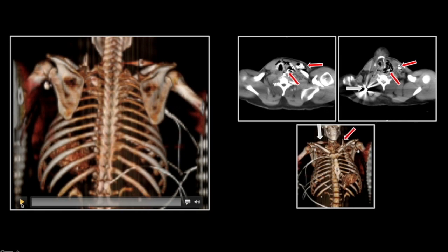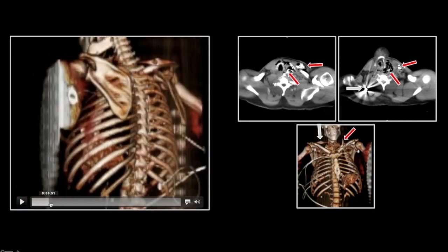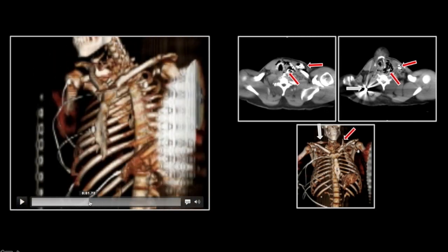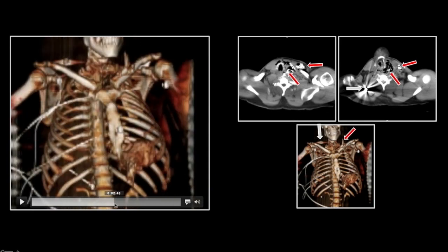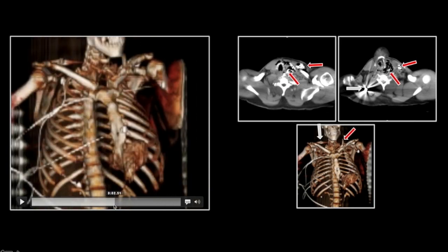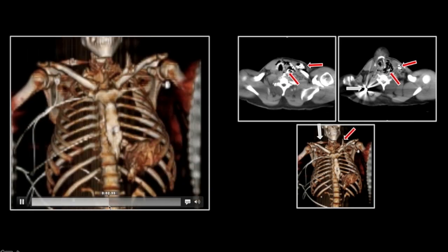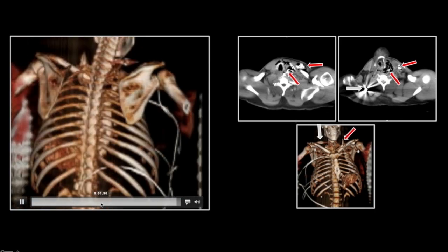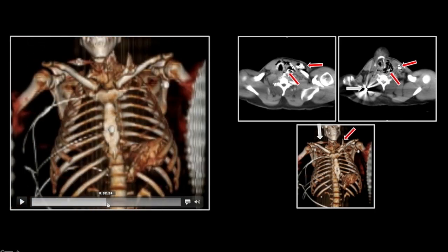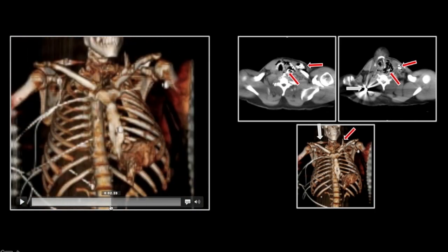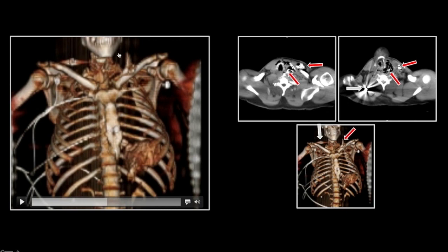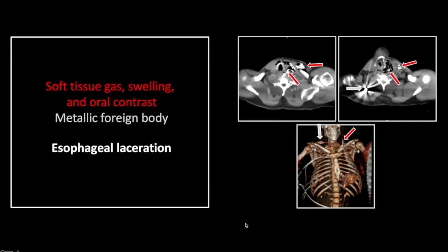Here on the 3D, you can appreciate that contrast collection, which looks very much like bone, in that supraclavicular region. So that is an esophageal laceration resulting from a gunshot wound.